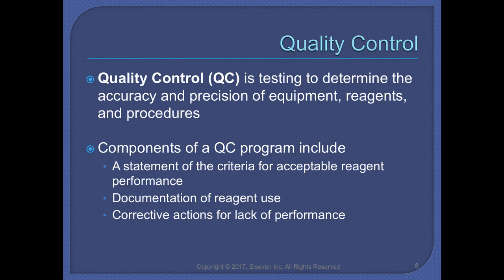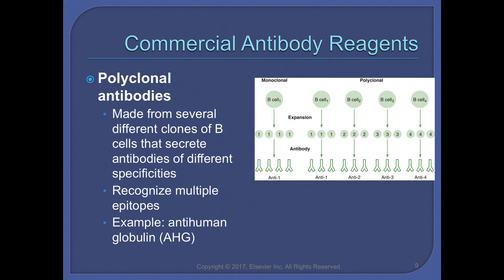So that would always have to come next to the date that I performed the QC, and next to all of the other documentation that is necessary for quality control. So quality control of reagents, also equipment and procedures, which we'll talk about later on, is very critical in the blood bank lab as well as it is in other labs.